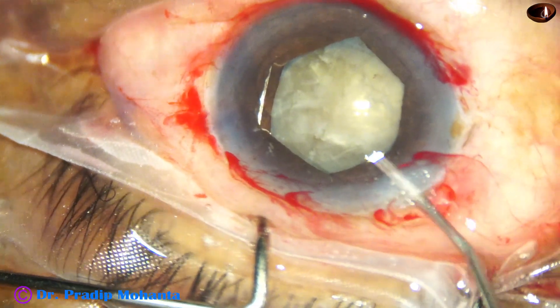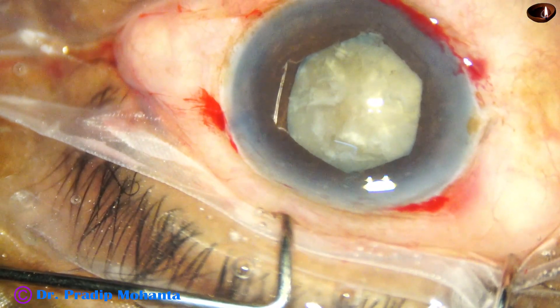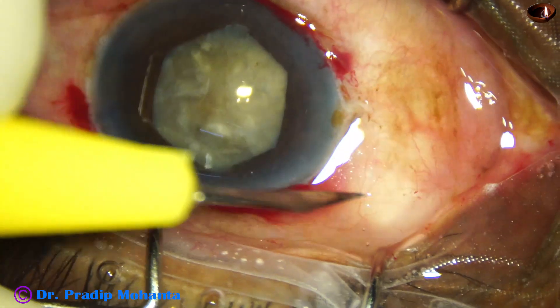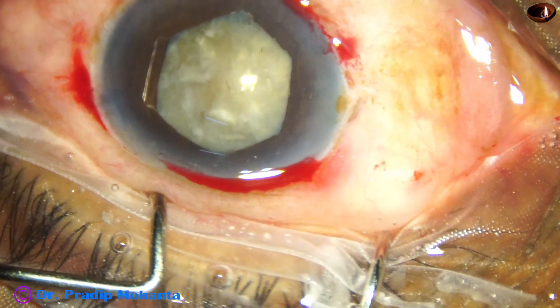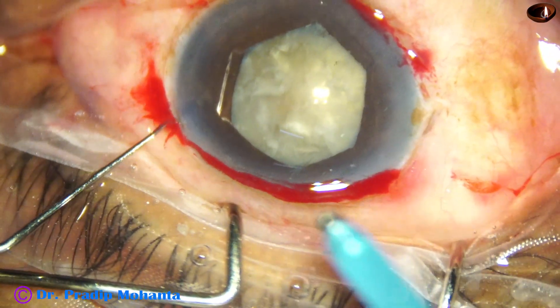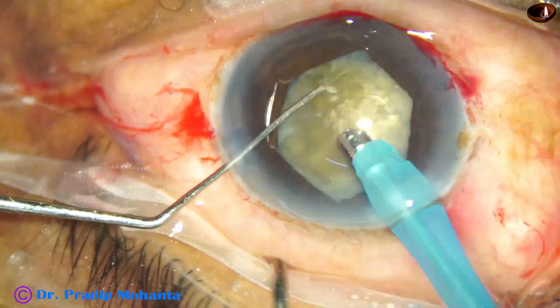Bimanual rotation causes the least amount of stress on the zonules. Now is the time to go into the eye with the handpiece. There is a nick on the conjunctiva because the conjunctiva is swollen due to peribulbar injection. The phaco handpiece goes into the anterior chamber with its bevel down; some superficial cortical lens matter is removed. Now watch submarine chop.